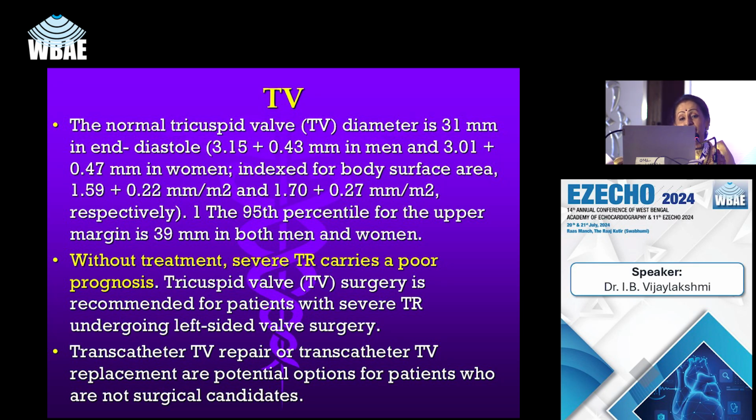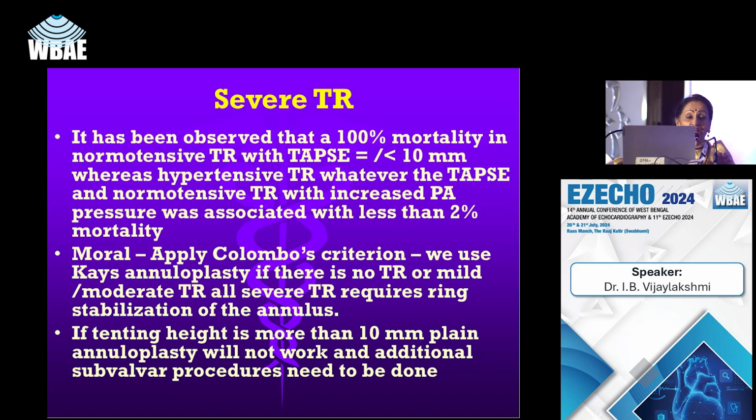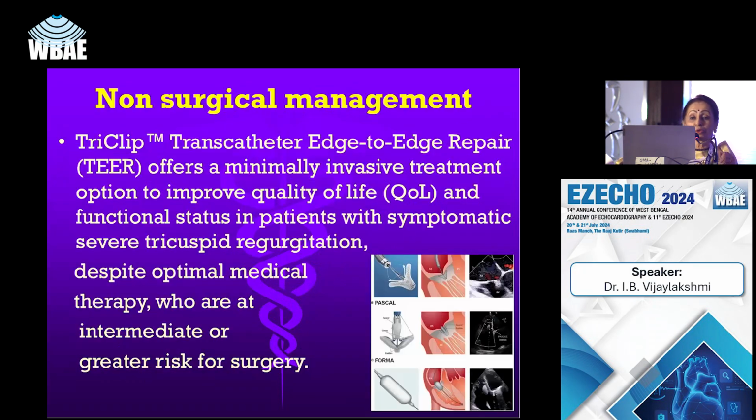Then tricuspid regurgitation is almost 70 to 85% of the time a functional one, that is secondary to the pulmonary hypertension. But in the remaining, if it is the organic one, then we have to tackle the valve. So tricuspid regurgitation is assessed in the apical 4-chamber view, with CW Doppler and the vena contracta, and apart from that, grading differs in tricuspid regurgitation. We have mild, moderate, severe, massive and torrential.